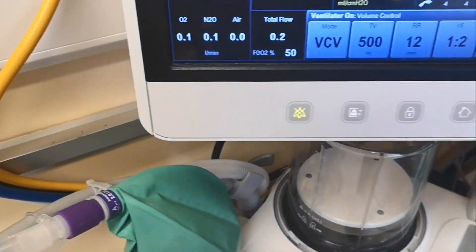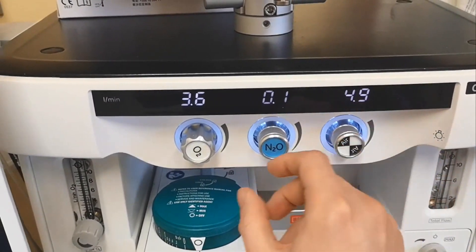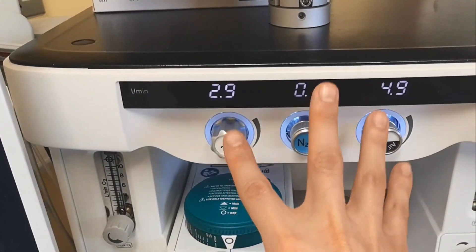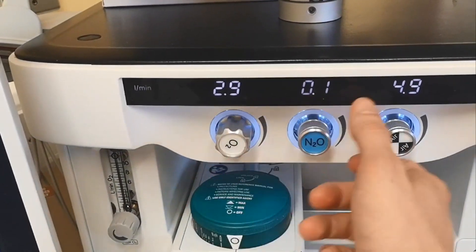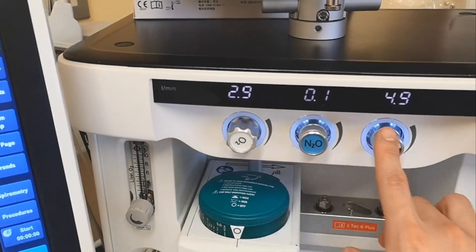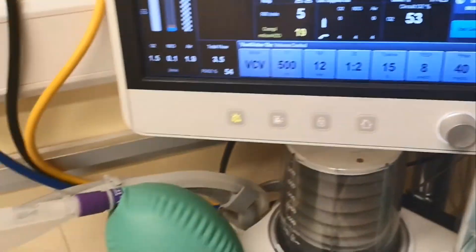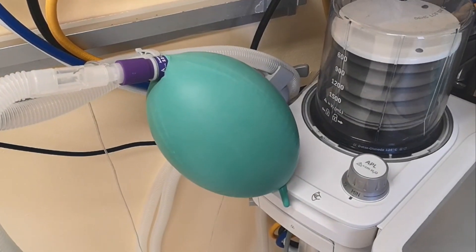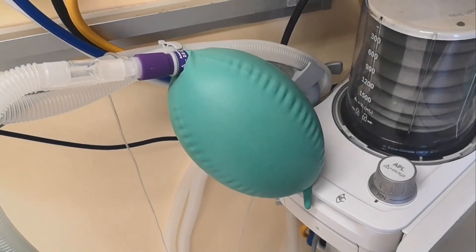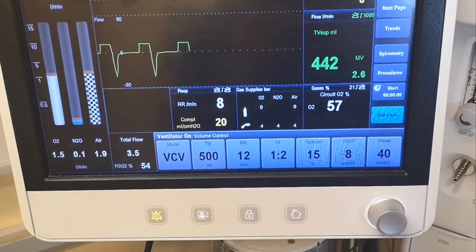You have to have the gas flow running. In the other machine you had fresh gas — that's the fresh gas here, you just dial it with the knobs. So you're doing 2.9 liters of oxygen per minute and 4.9 of air, and then you can bring it down or up according to what you need. The patient is ventilating — the machine is pumping air into the lungs with the parameters we've set.